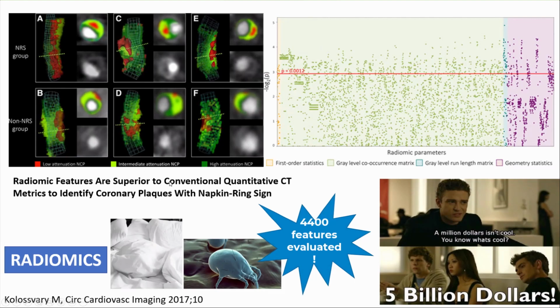and look at the radiomic features? So radiomics is a technology that looks at things the human eye can't see. It looks at how the individual voxels relate to each other, the grayscales within those voxels, the texture. So you end up analyzing your region of interest with 4,000 features rather than just 4. What's cooler than a million? A billion. The same applies. What's cooler than 4,000? So this is radiomics, being able to analyze at a voxel level stuff beyond the human eye.